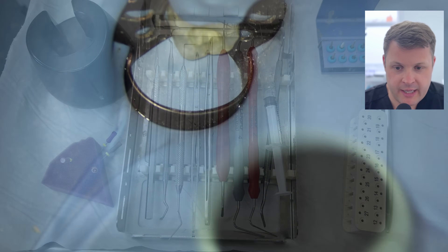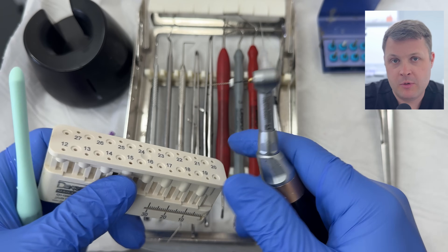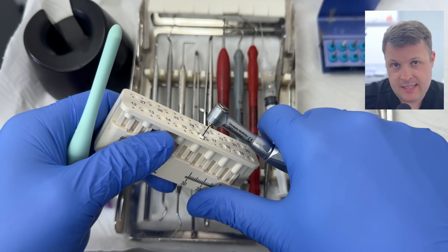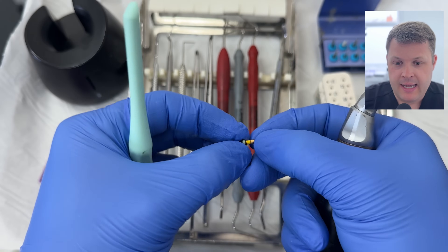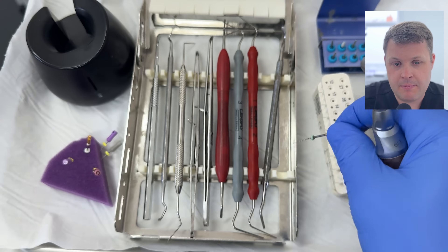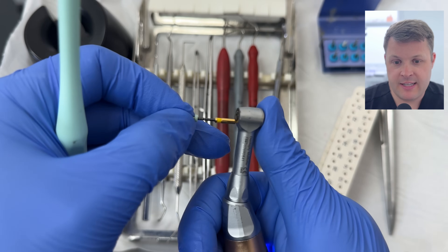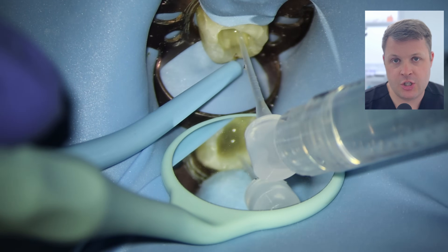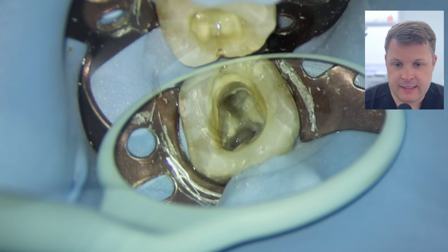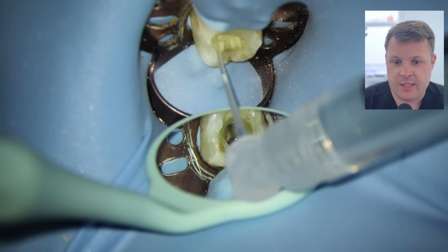I'm going to irrigate this distal canal significantly — if there's debris or pulp tissue down there, keeping the irrigant flowing might open it up for later negotiation. The mesial canals are quite sclerosed, so I'm going to open up the coronal to mid-third using a glide path file only up to 16 millimeters, not pushing any further. Then I'm going to use a size 20/04 at 16 millimeters — again, just to open up the coronal to mid-third. This is essentially what stops a hand file from negotiating most of the time. When we look at the two canal orifices now, they look nice and open with good symmetry.